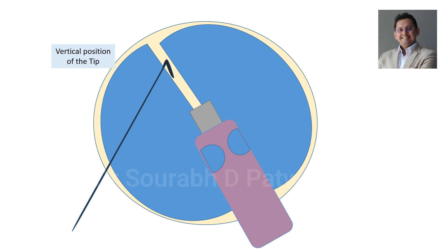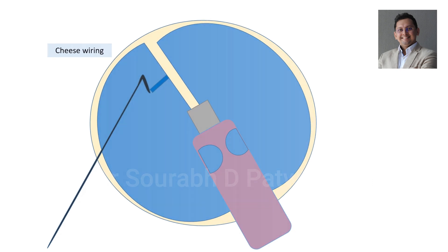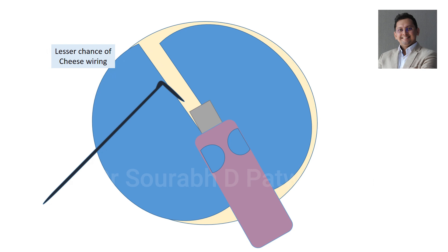Usually we use a vertical position of the tip when we are doing trench and divide. But in case of soft cataract, this leads to cheese wiring because the nucleus is very soft. Instead of that, if we use the horizontal position of the tip, then it puts pressure on a wider area and there is a lesser chance of cheese wiring.